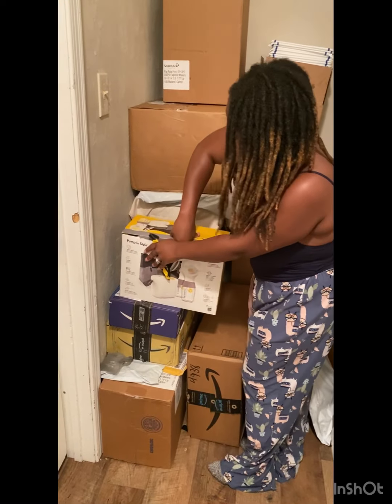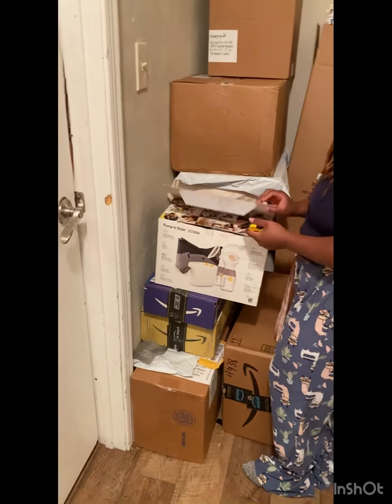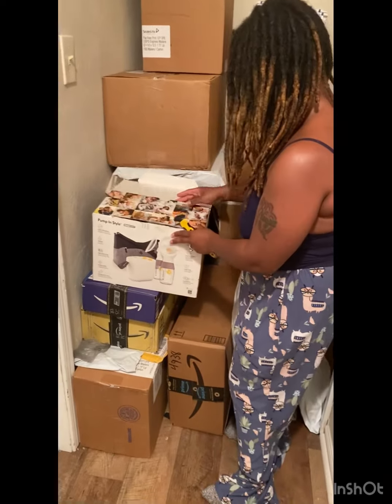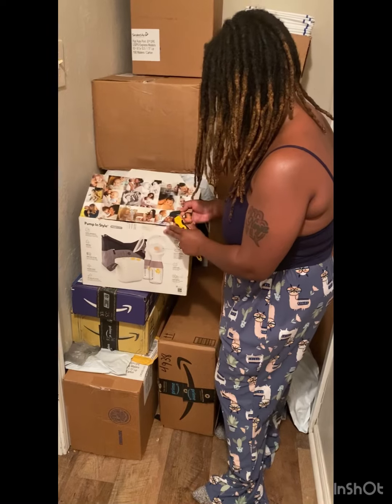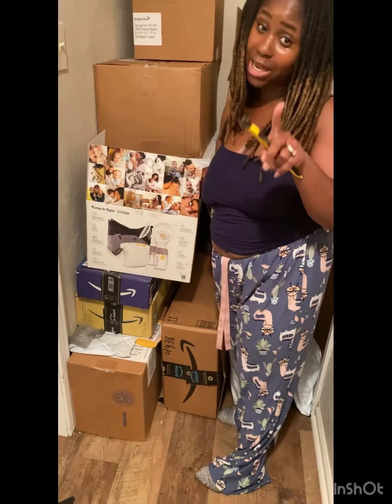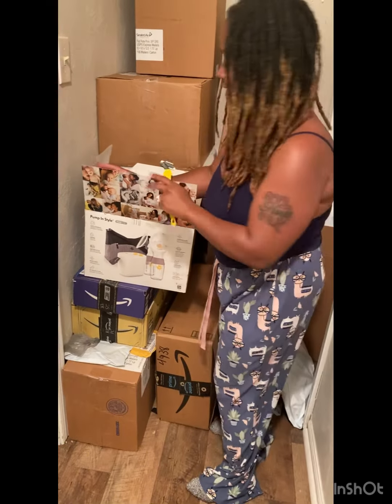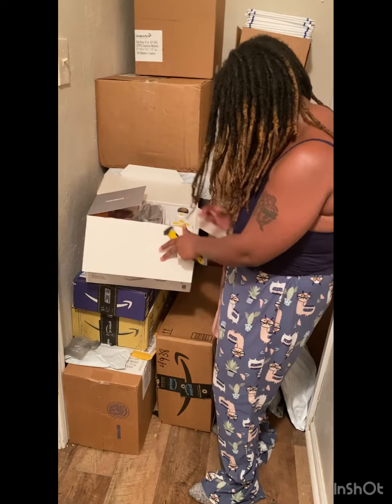All right. Y'all, look at this. Oh, I like this unboxing stuff. Look at this. Y'all, I should have been started this unboxing stuff. Let me tell you why — because we get at least 30 packages a week, you guys. Oh my God. Y'all, look at this.